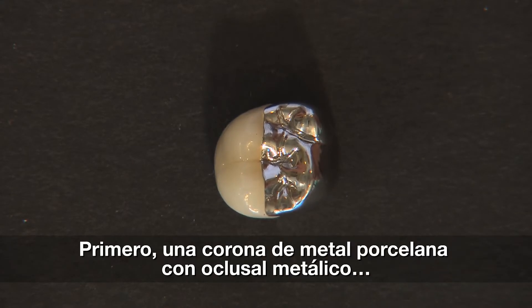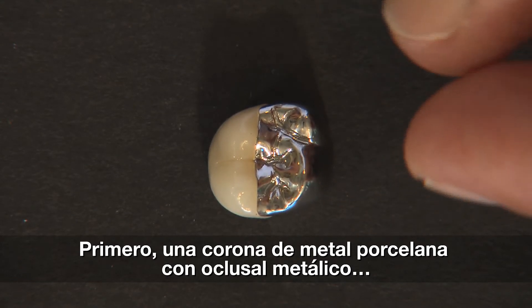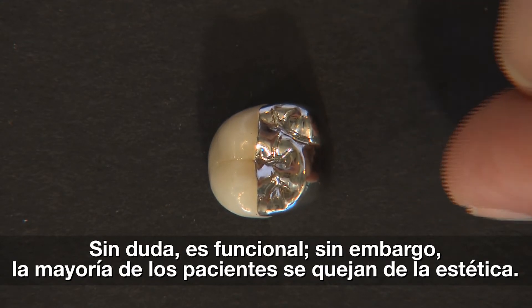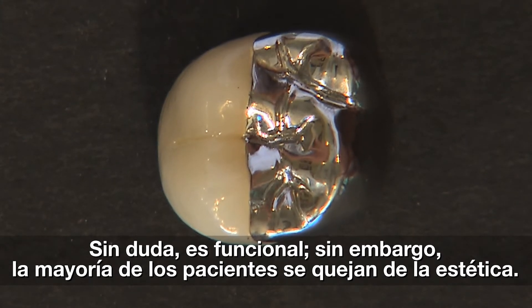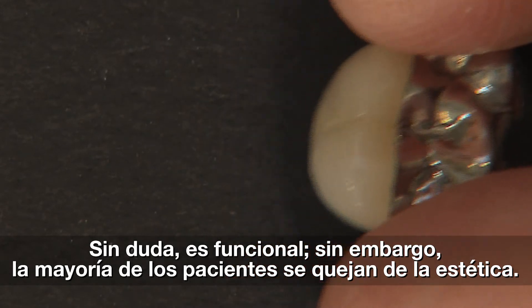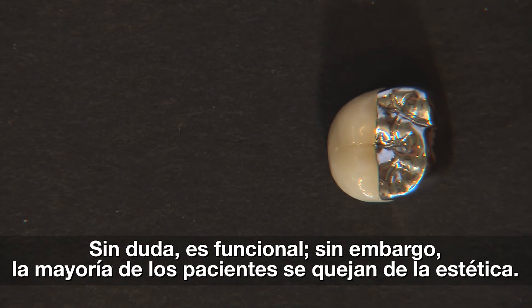One option for a crown prep where we have limited interocclusal space is to use a metal occlusal PFM, as you see here. It's an okay solution — there's really nothing wrong with it from a functional standpoint — but patients aren't real thrilled when they see it. I remember early in my career having a woman question the $750 she'd spent on a porcelain crown, asking why it was half metal on top and half metal on the inside. She could see it with a mirror on the lingual. So that's a solution, but it's not one where the patient is going to say, "Great idea, doc."